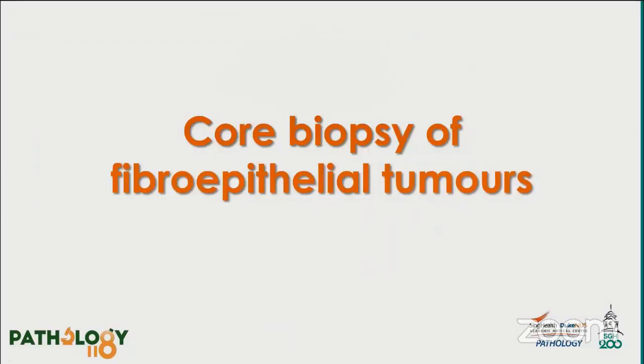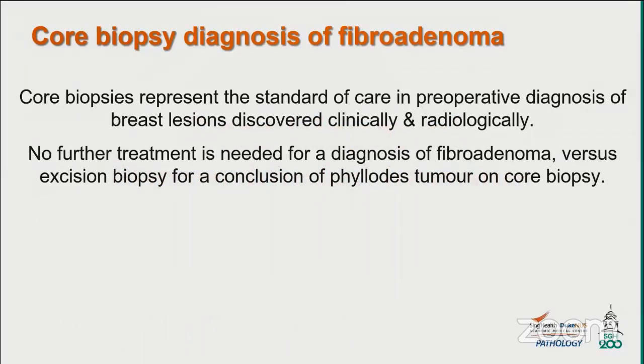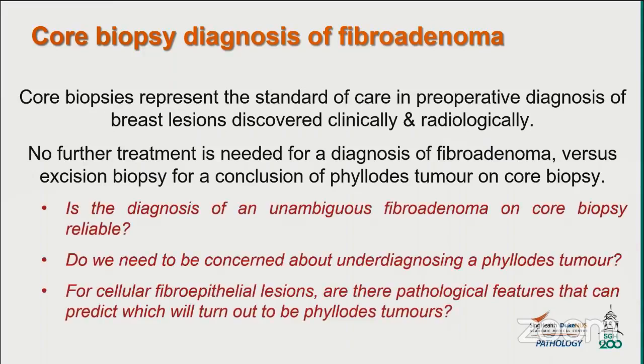Moving now to the core biopsy of fibroepithelial tumors. Core biopsies, as we know, represent the standard of care in preoperative diagnosis of breast lesions discovered clinico-radiologically. No further treatment is needed for a diagnosis of fibroadenoma on core biopsy, versus the need for considering excision biopsy when the conclusion of phyllodes tumor is made.